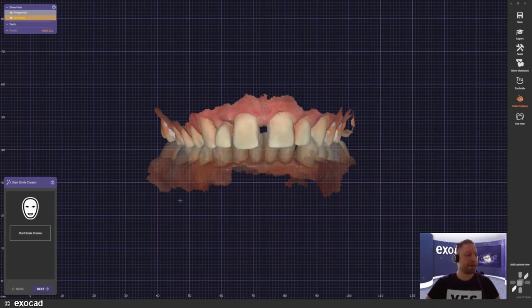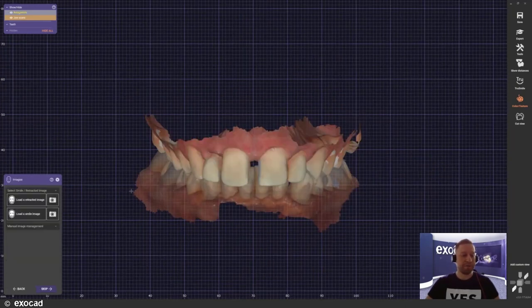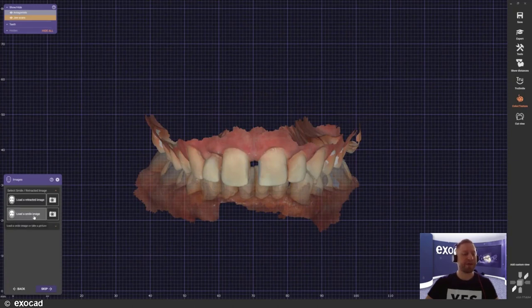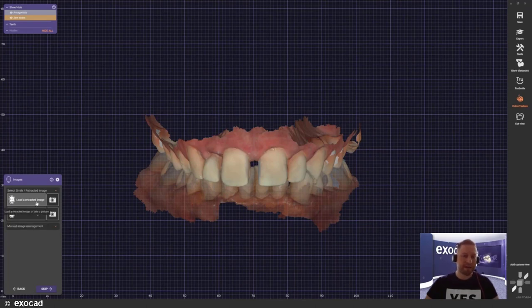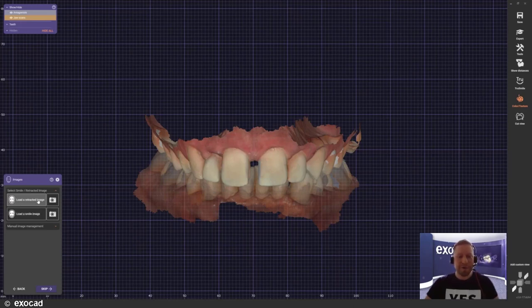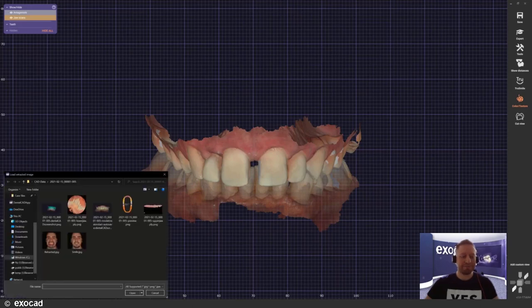When we start in the software, the wizard begins and we go right into the smile creator, where we get two options. First we want to load a retracted image of the patient as well as a smiling image. You can proceed without a smiling image, but to enjoy the full functionality of the software, I would say use both — it will make things a lot easier.